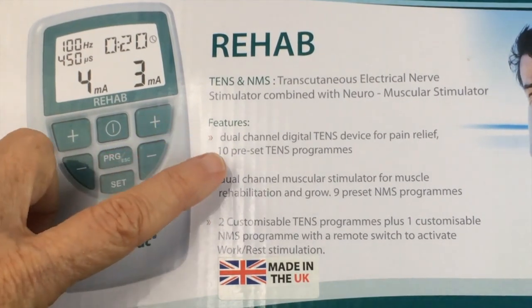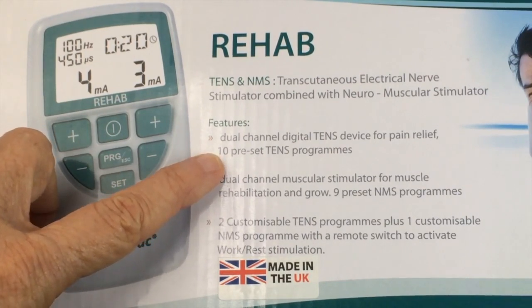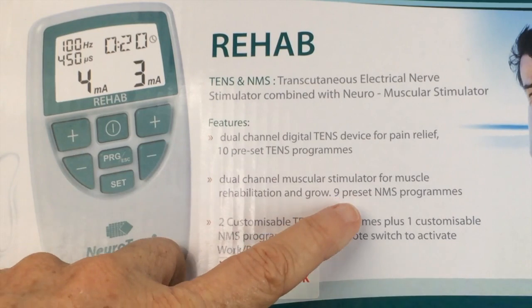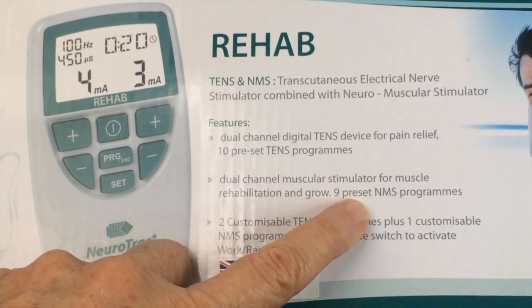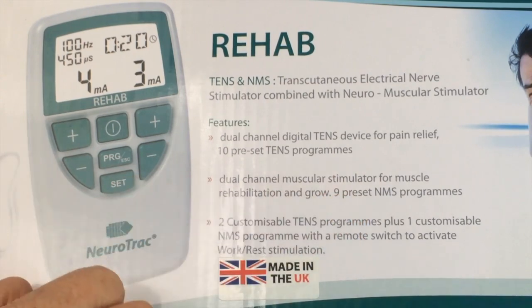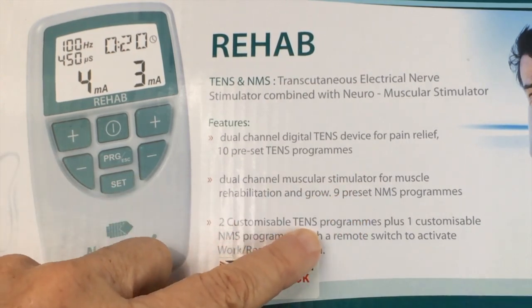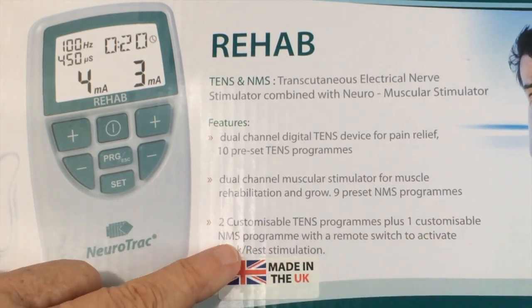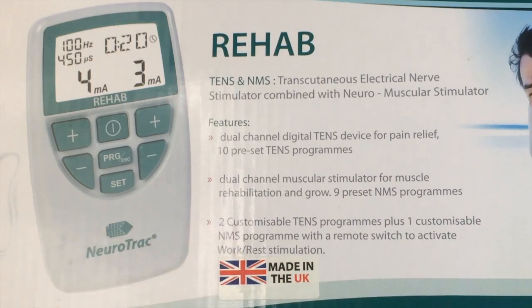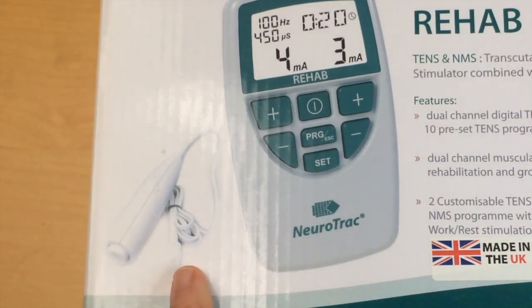The main features are also shown here on the front. There are ten preset TENS programs, nine preset ESTIM programs, two customizable TENS programs and one customizable ESTIM program, together with a remote switch which you can use to activate the work-rest stimulation shown here on the side.